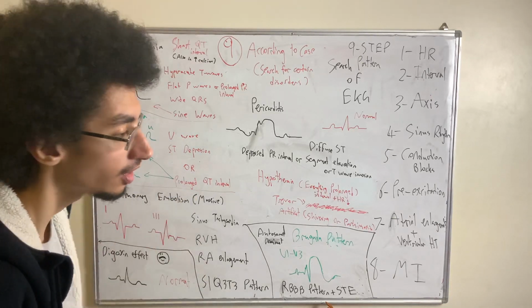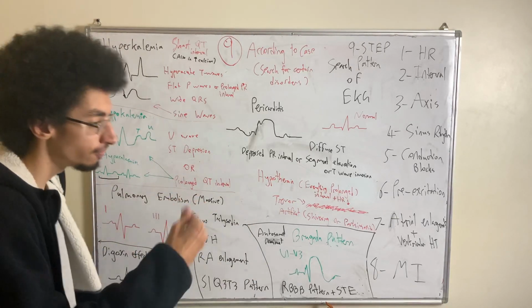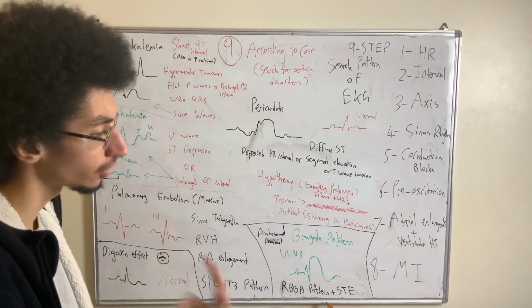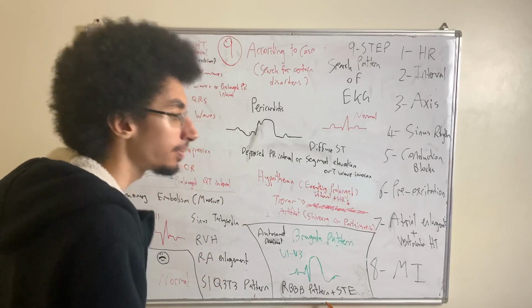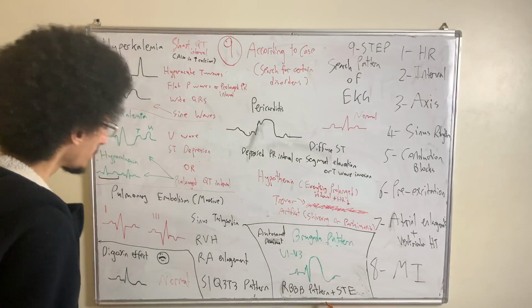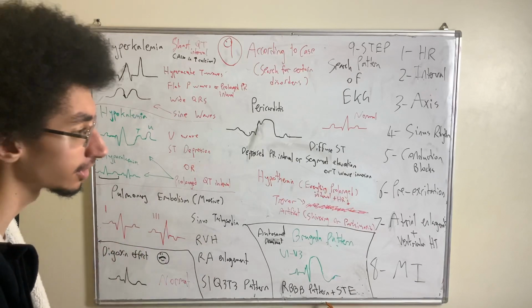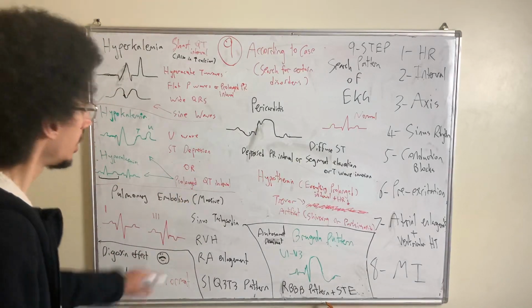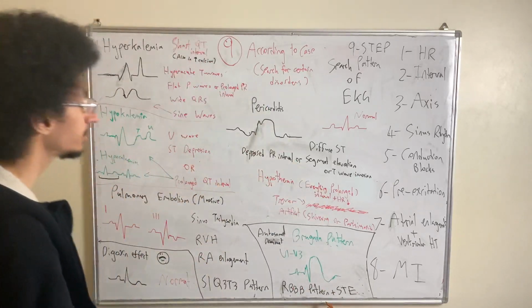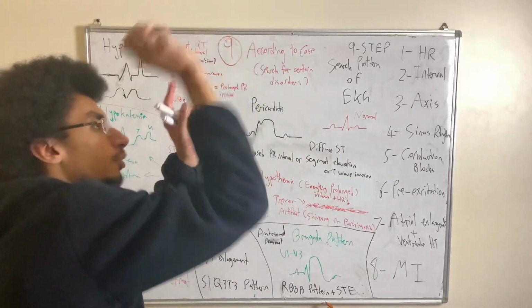that will lead to pulmonary embolism, with signs and symptoms. Now it could be asymptomatic, or it could be massive, very symptomatic, very severe. And it can lead to the person complaining of chest pain, shortness of breath, past history of pain in his calf, and all that stuff. Regarding the EKG findings of pulmonary embolism, a lot of the findings are non-specific. A lot of them are related to the action of the right ventricle, the right ventricle having to contract against an obstructed pulmonary artery.